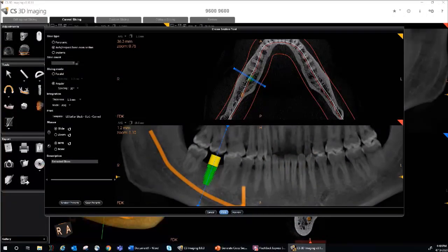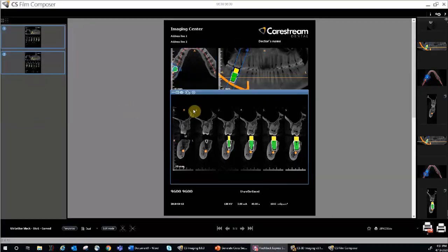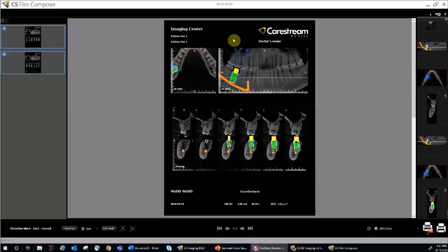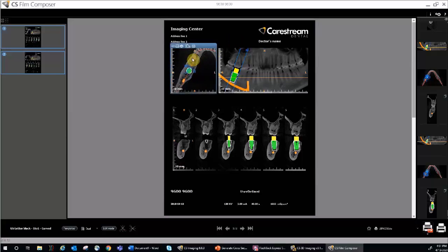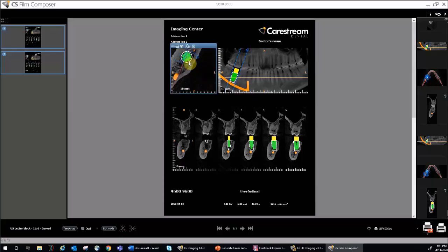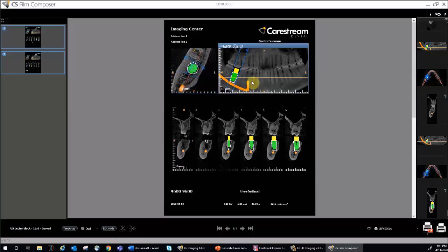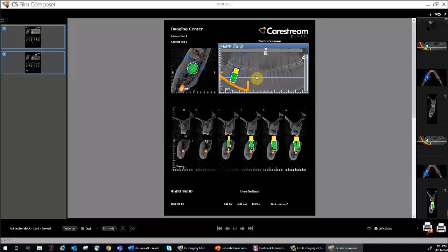This is the report generated for parallel with a slice count of 12. Notice you can right-click and drag your image within the frame to adjust its position. You can also use the scroll wheel to zoom in and out and then adjust. If you wish to adjust brightness and contrast, simply left-click and drag across your image, either up or down, or left or right.